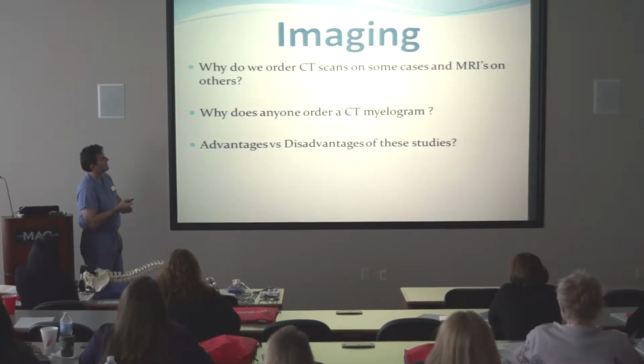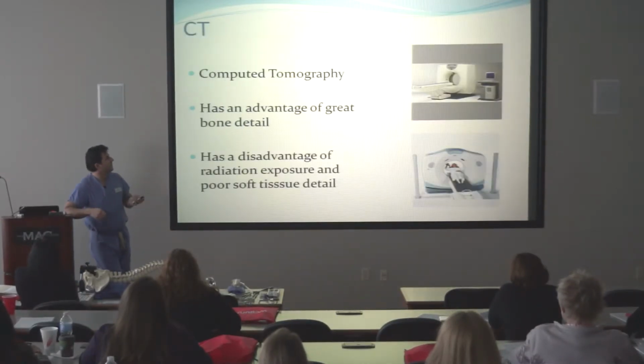So why do we ever CT scan, in some cases MRIs and others? What's a CT myelogram? Why do we get that? Advantages, disadvantages of these studies, okay?